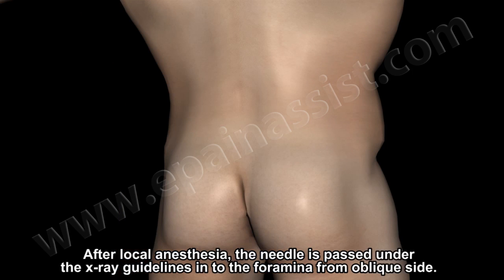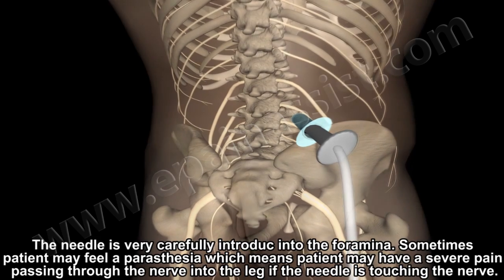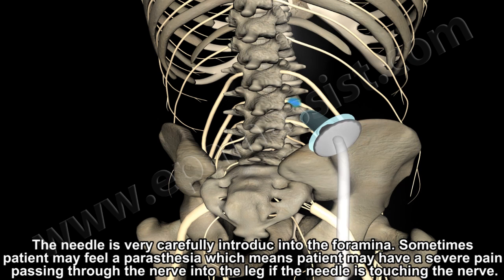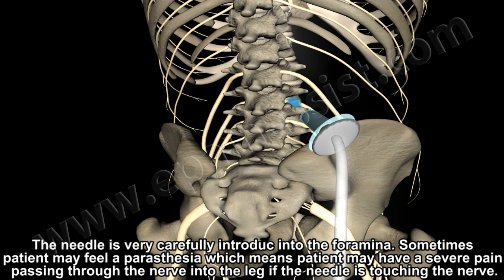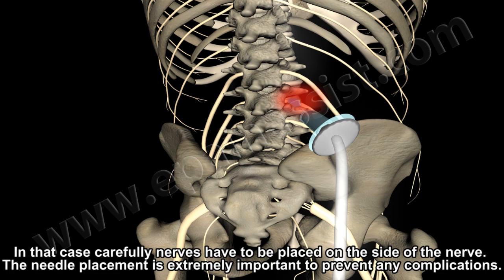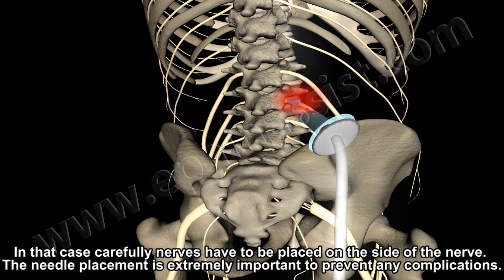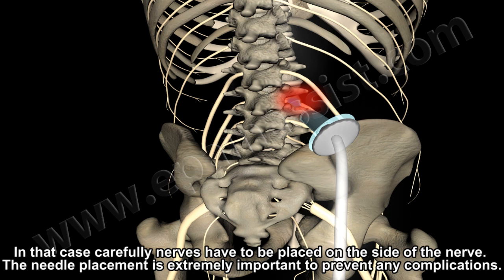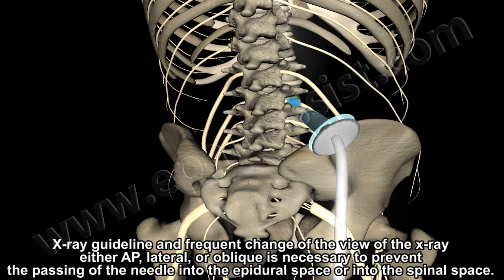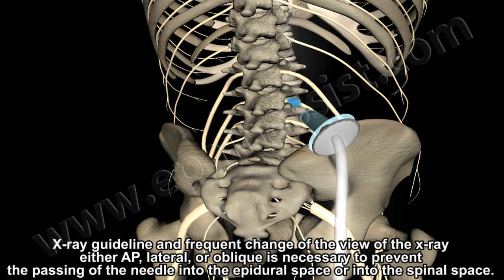After local anesthesia, the needle is passed under x-ray guidance into the foramina from the oblique approach. The needle is very carefully introduced into the foramina. At times, the patient may feel paresthesia — a severe pain radiating through the nerve into the legs — if the needle touches the nerve. In that case, the needle must be carefully repositioned to the side of the nerve. Needle placement is extremely important to prevent complications. Frequent changes in x-ray view — anterior-posterior, lateral, or oblique — are necessary to prevent the needle from entering the epidural or spinal space inadvertently.